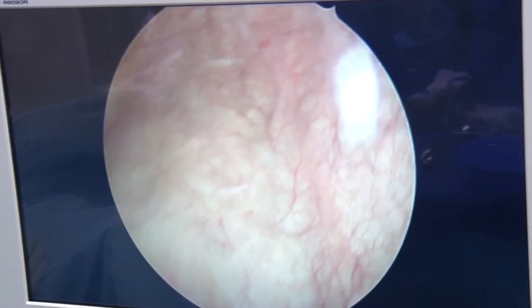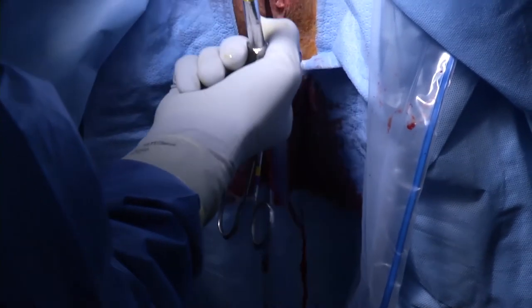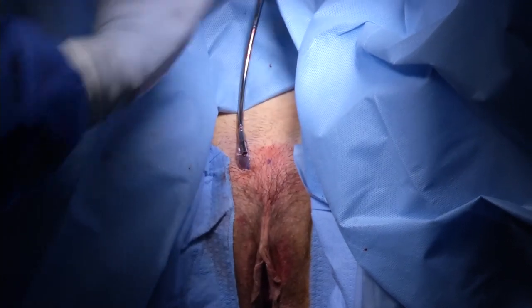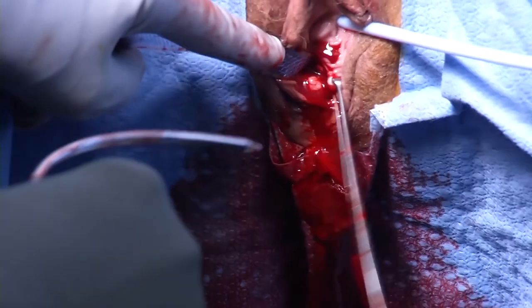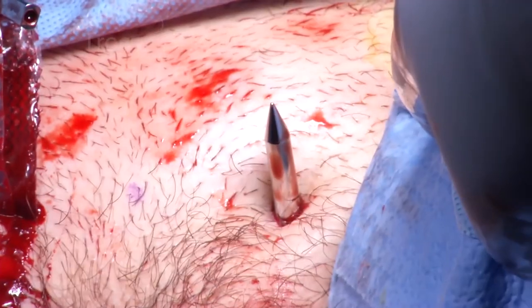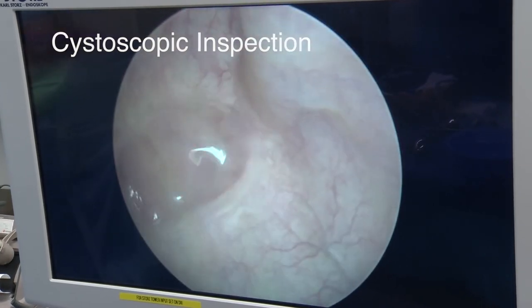Had the trocar been visualized within the bladder, the trocar would have been removed and re-passed. Care is taken to make sure the mesh is not twisted before the same maneuver is performed on the opposite side with the other trocar. Repeat cystoscopy after the second trocar placement confirms there is no evidence of cystotomy.